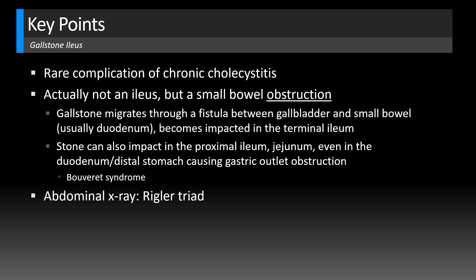On abdominal x-ray, look for Rigler's triad — and don't confuse that with the Rigler sign, which is when you have pneumoperitoneum outlining the bowel wall. Rigler also named his triad here: small bowel obstruction, pneumobilia, and a gallstone in the right iliac fossa. Note that gallstone ileus is definitely not the most common cause of pneumobilia — we see that often after procedures like ERCP where a sphincterotomy is done, which is an expected finding that can be seen for months to years and is not concerning. But you want to look for these additional secondary findings when you see pneumobilia.